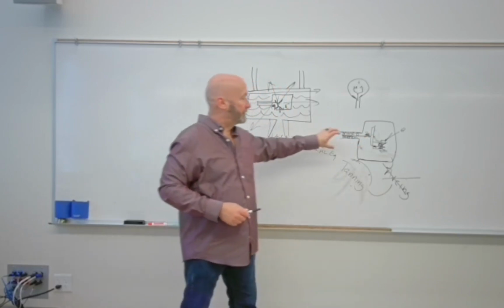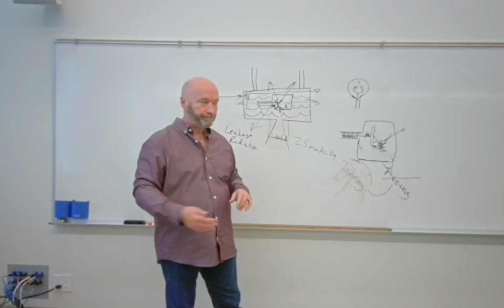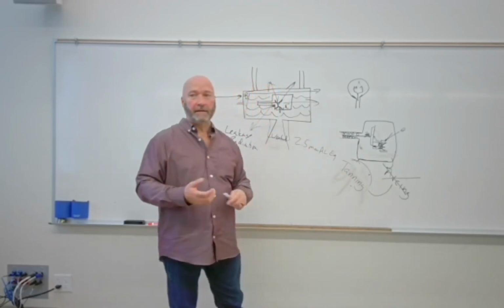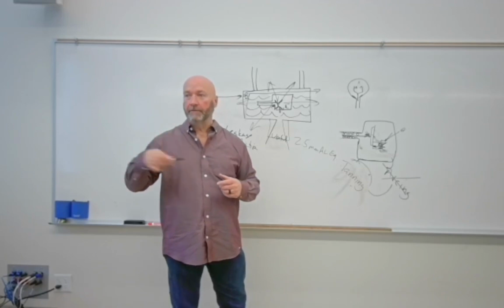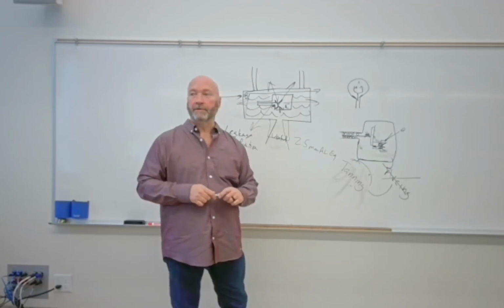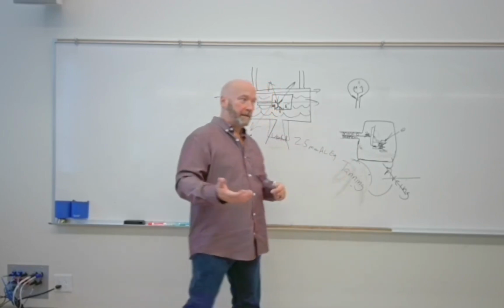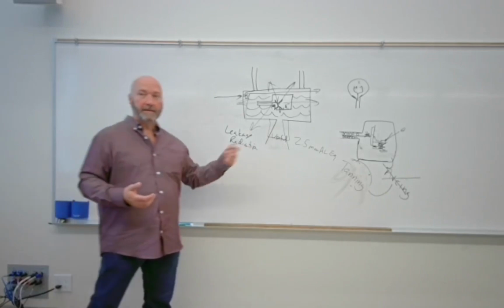Okay, because if they get hot enough and they lose that lubrication, then what's eventually going to happen is they're going to wear out. They may weld themselves together, and now you've got a stationary anode. Well, what was the purpose for rotating the anode? To disperse heat. Dissipation of heat, right? So if now we've got a stationary anode, we don't dissipate the heat very well. And again, we're back to a situation where the heat's going to kill the X-ray tube.